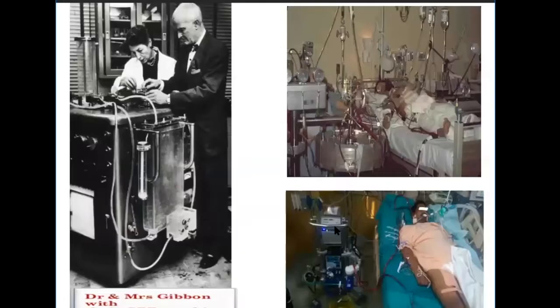Now, if you look at the picture, we can see how ECMO has evolved. Here we can see a bypass machine which was used almost around 1930 by John Gibbon and his wife, who started in the operation theater. If you look at this machine, the membrane was a bubble oxygenator. There is a difference between the bubble oxygenator and the membrane oxygenator. The bubble oxygenator is a large machine which cannot be shifted out from the OT. So probably this is the first bypass machine which was used.